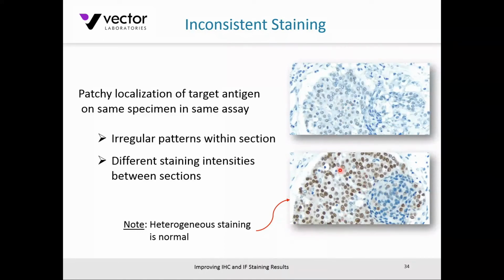Run in the same assay on different slides. You're getting some nice defined nuclear staining here. You can clearly see it contrasted with this blue hematoxylin counterstain. But maybe three slides down, you're starting to see this irregular or differential staining intensity between slides in the same assay. And this is a little confounding to investigators.